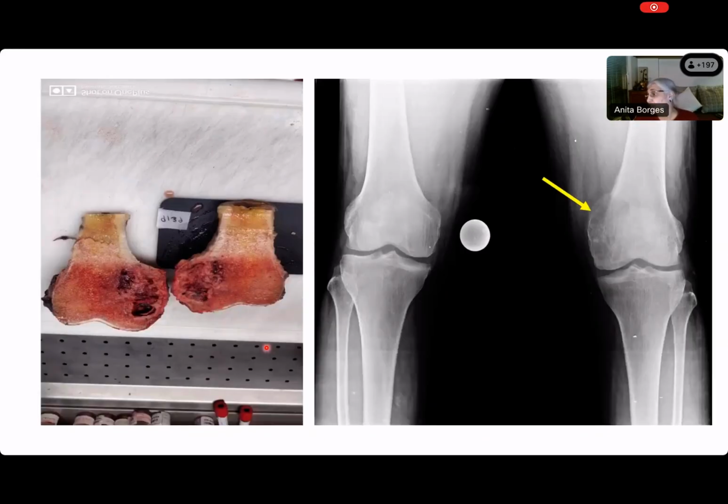All right. So we gave some diagnosis, and they resected the lower end of this femur, and you can see this. You'd like to describe this, please, Sarangi? Grossly, we can see that a very large hemorrhagic area is present on the distal end of the femur, and the lesion is seen on the medial side, and on the upper part, the normal cortex and marrow of the bone is seen.